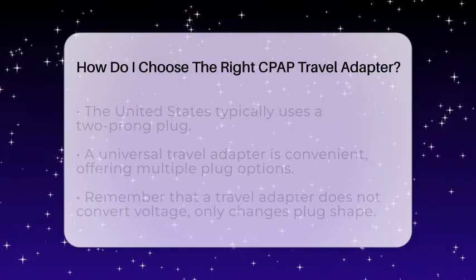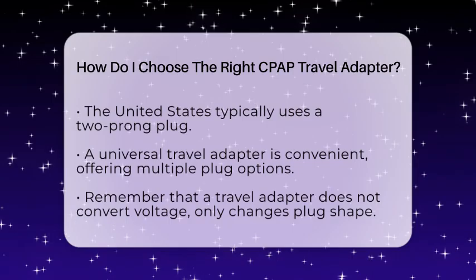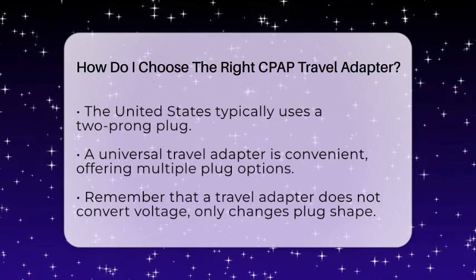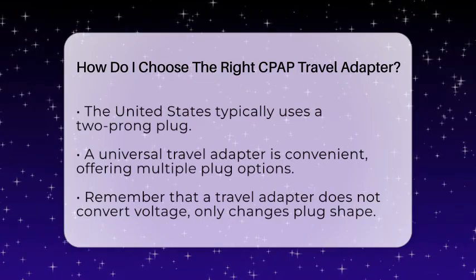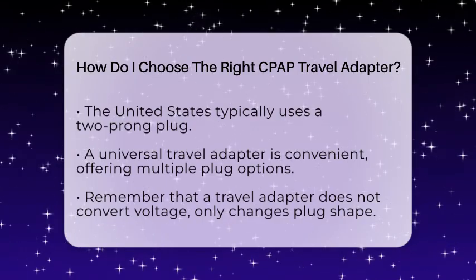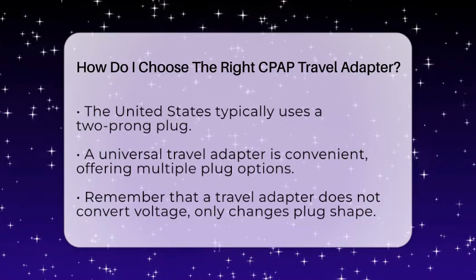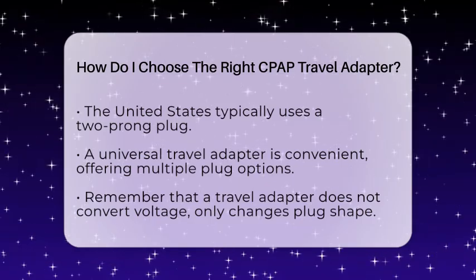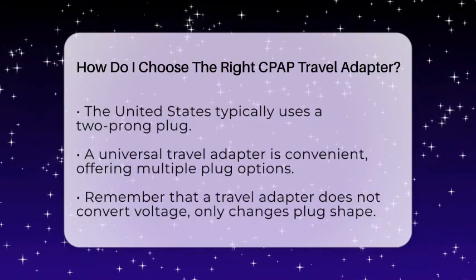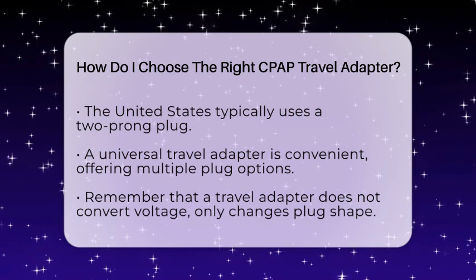A universal travel adapter that includes multiple plug options for Europe, the United States, the United Kingdom, and Australia is often the most convenient choice. It is compact and easy to carry. It is also important to remember that a travel adapter is not a voltage converter. It only changes the shape of the plug to fit the outlet. Using a travel adapter with a device that is not rated for the local voltage can potentially damage your CPAP machine.